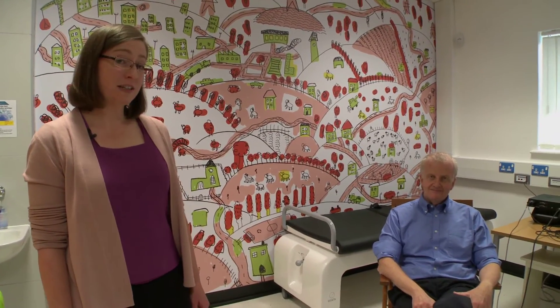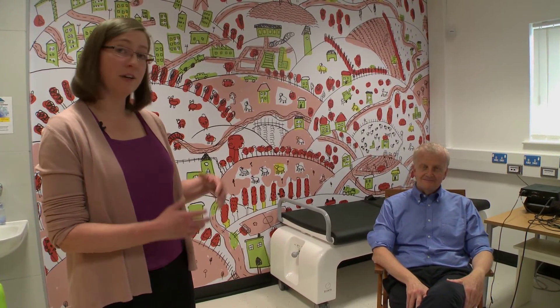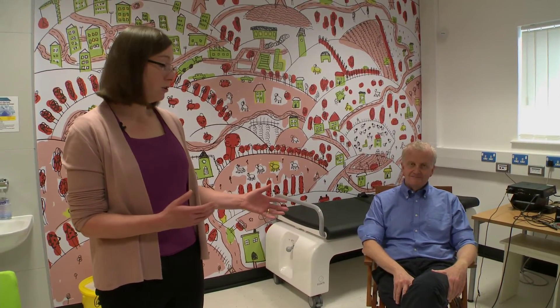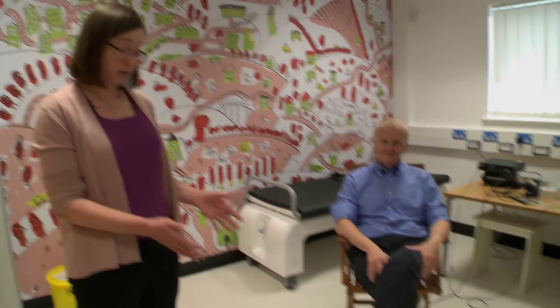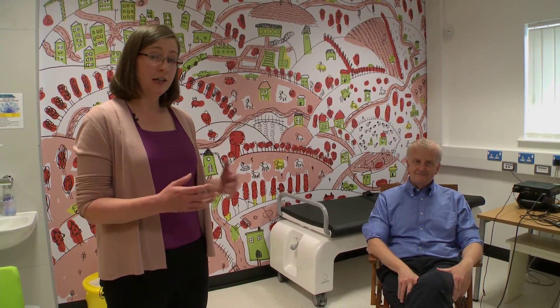Stefano is going to be our volunteer today, and the first thing we'll notice about him is that he has taken off anything that was on his body that might contain metal. So he's not wearing his watch, he's not wearing his belt, he's not wearing his glasses, and he's also taken his shoes off because your shoes can contain small bits of metal as well. This is really important because if you're wearing any metal when you go into the MEG system it won't work properly.